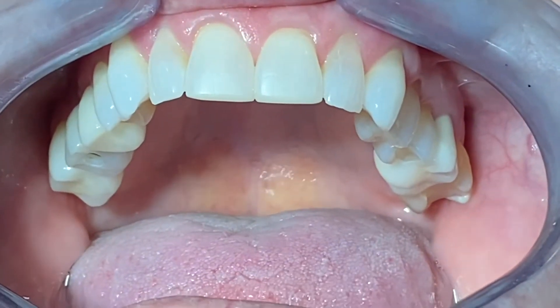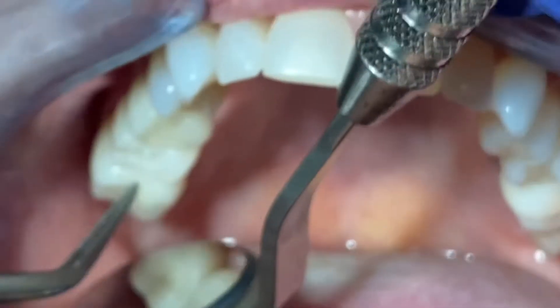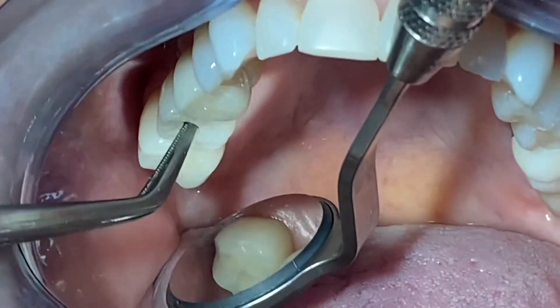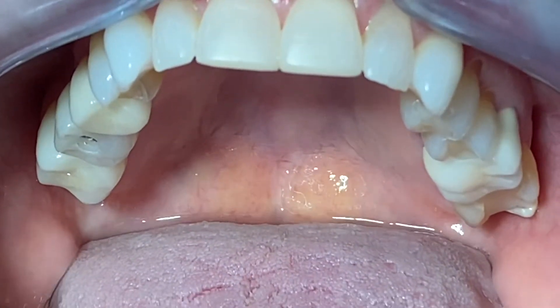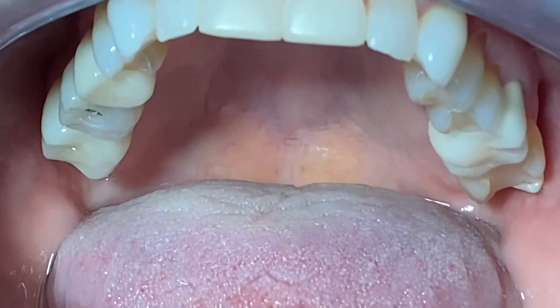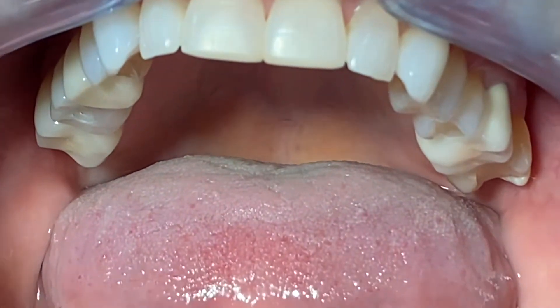Be aware that the implant is underneath the bone but the implant crown is above the gum, so there's a lot of potential for leaking — fluids can get in there. That's why you want to use a material that is not water-absorbent but water-resistant. After that, put some bonding and flowable or regular composite, cure it, and your case is done.